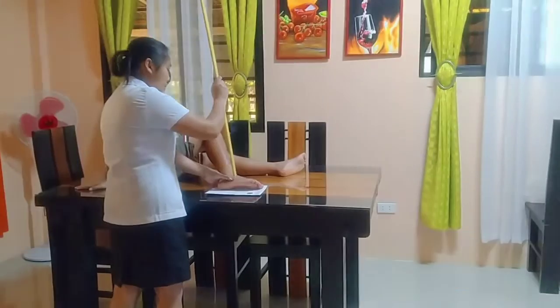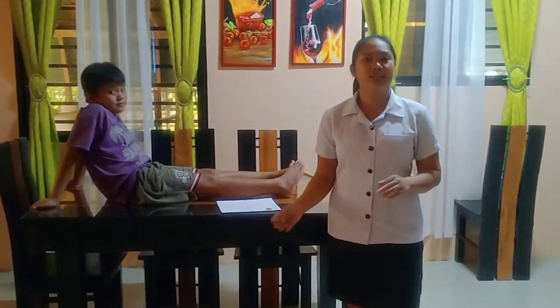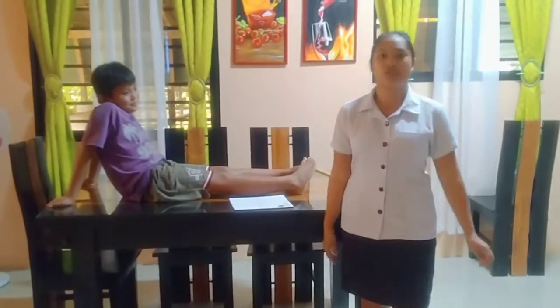So dito po papasok ang ating central ray. Yan. This projection shows the portion below the talus and the superior portion of the calcaneus.